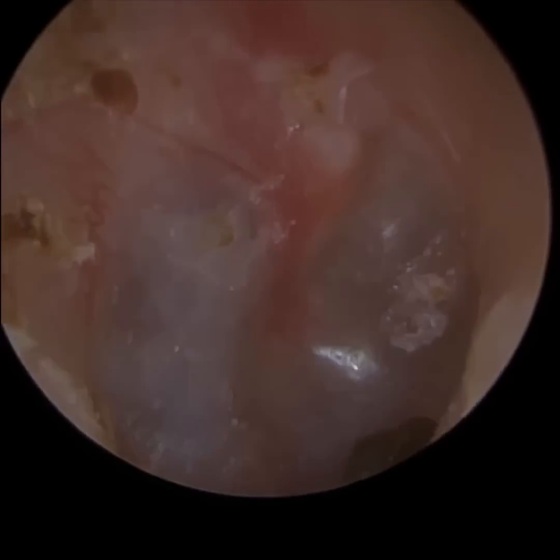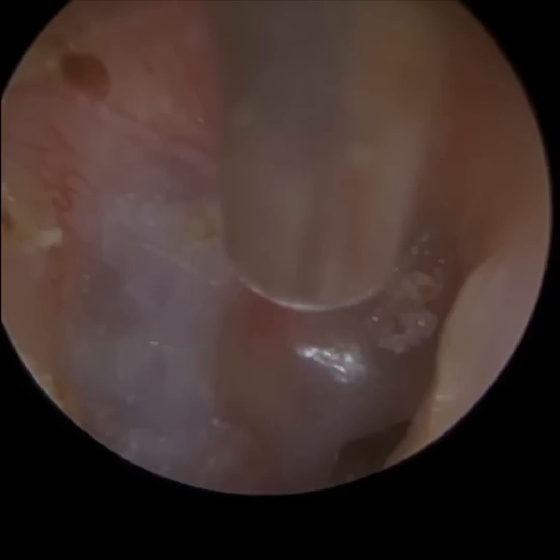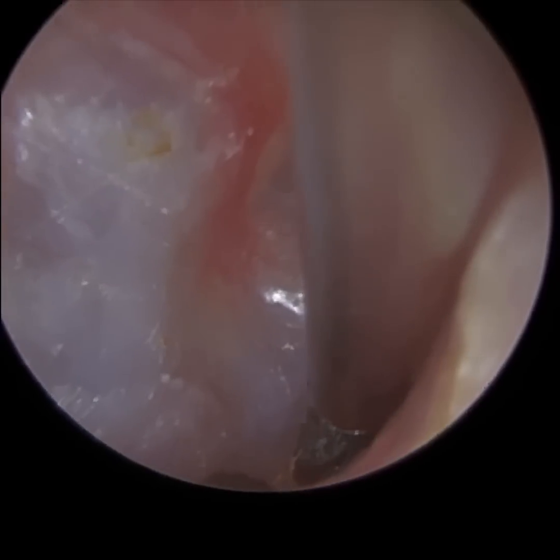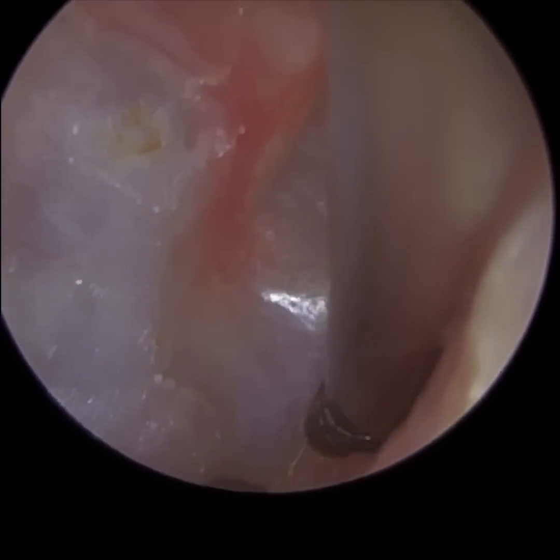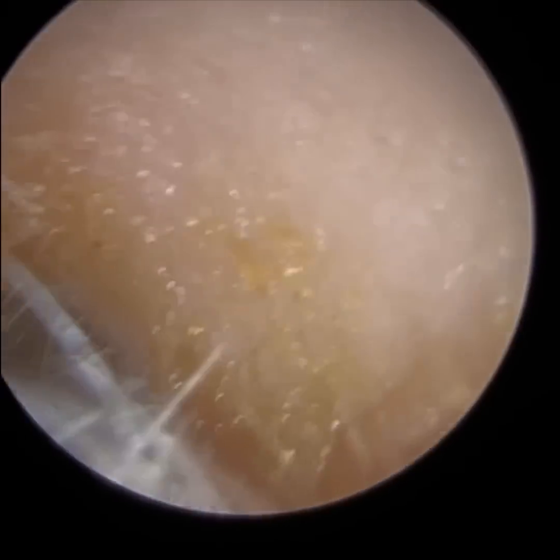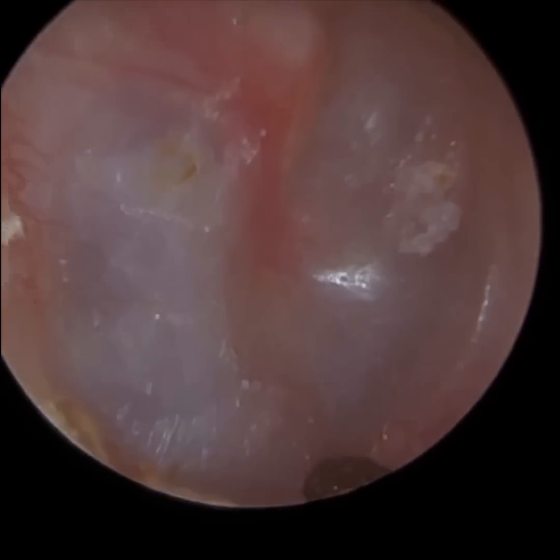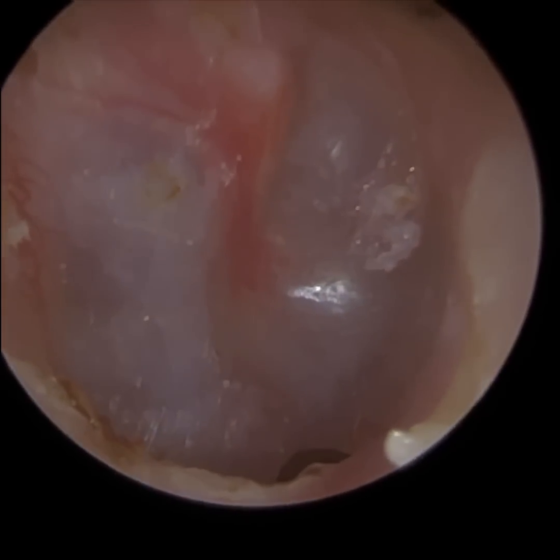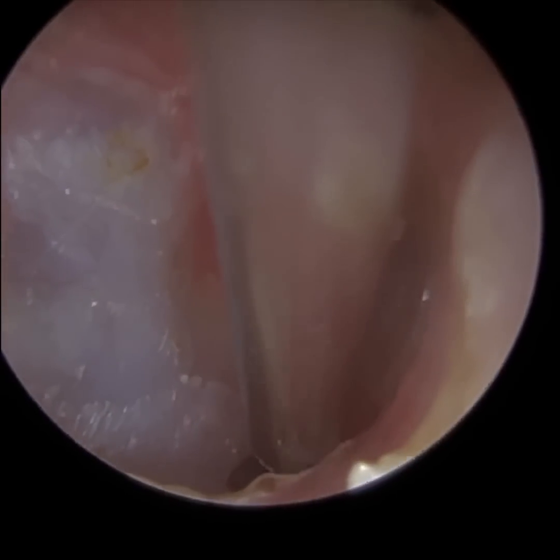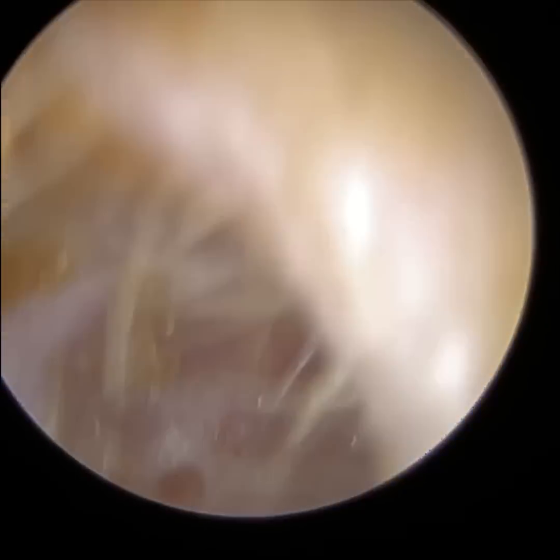And there's a couple there now in the inferior recess, and it's so difficult to view because as the ear canal approaches the eardrum, not only does it narrow in and widen back out, but it narrows upwards and then back down again, which creates a little trench, a little basin, the bottom part, the inferior recess. So you can see I think for this bit I was actually stood up and looking down into the patient's ear as they were sat.